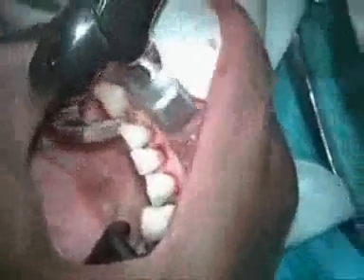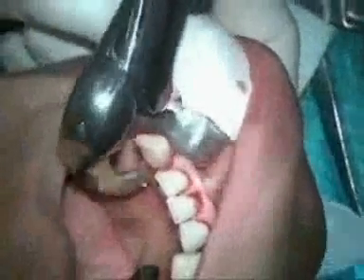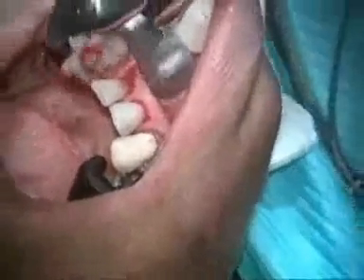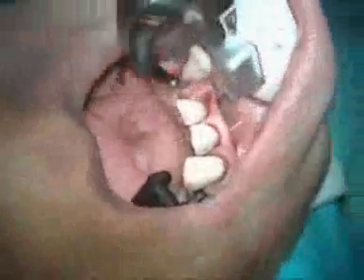You can see it's a very small movement that is achieved with the physics forcep to disengage it from the socket. Once the small movement is accomplished and the tooth has been disengaged, the forcep is repositioned. The bumper is placed on the crown and the tooth is removed occlusally.